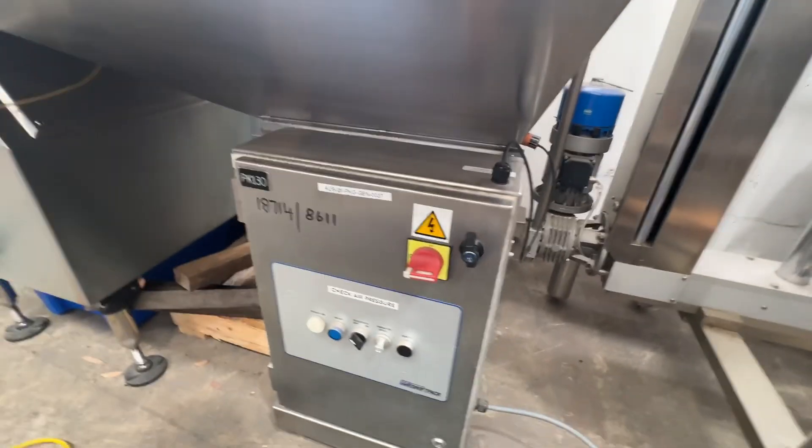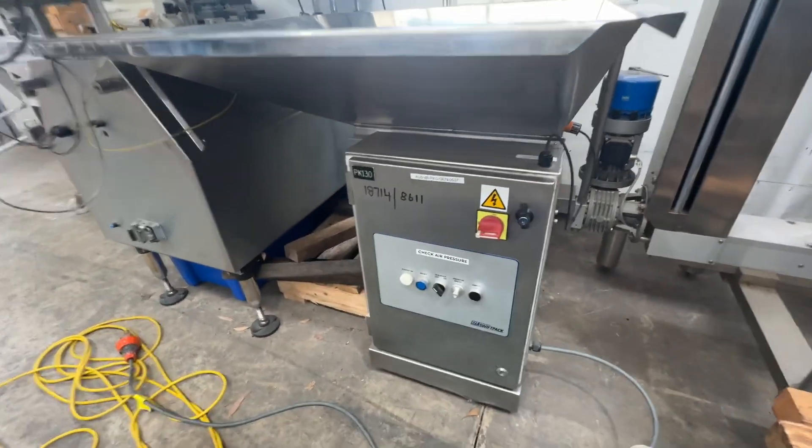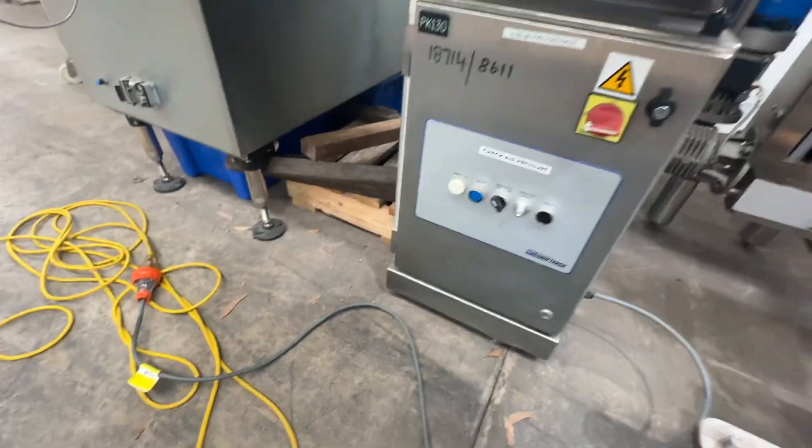I don't have air connections. I've got three single phase — obviously you guys need to change that to American standards. Currently it's 240 volts.